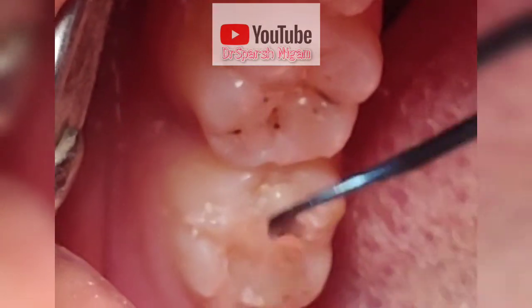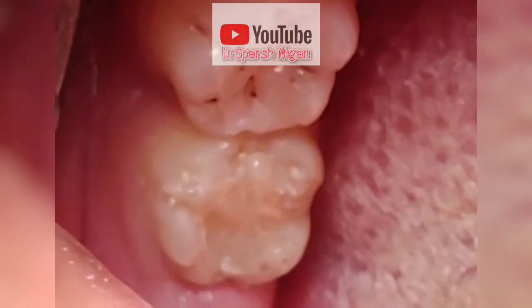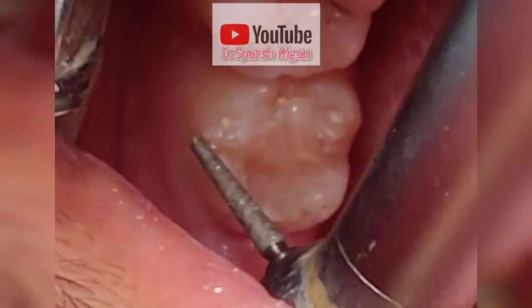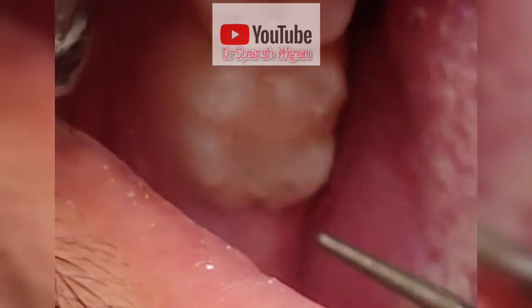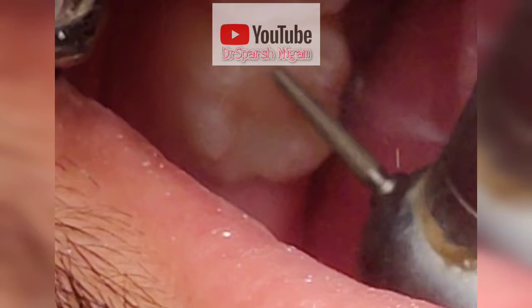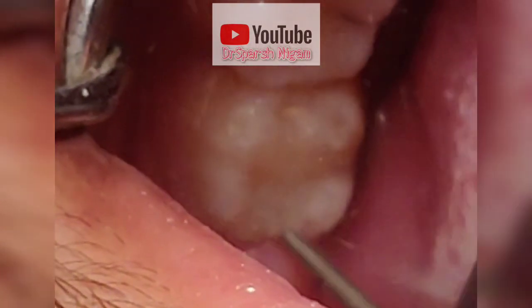Now I am going to finish the unsupported margins of the filling. As you can see, there are a few rough margins of the filling. Now I am going to finish it with the air rotor. You can see I am finishing the margins with a diamond bur that I am using in the air rotor.